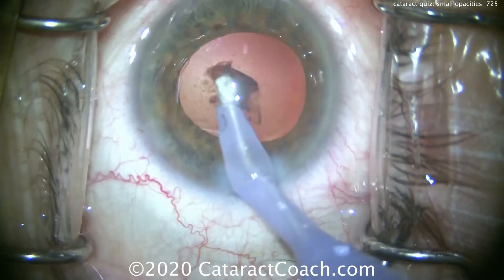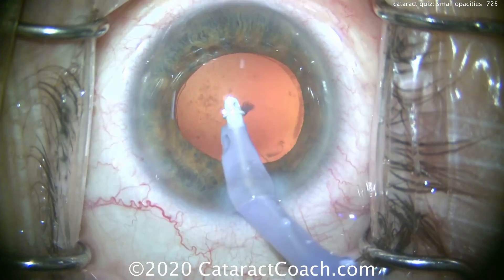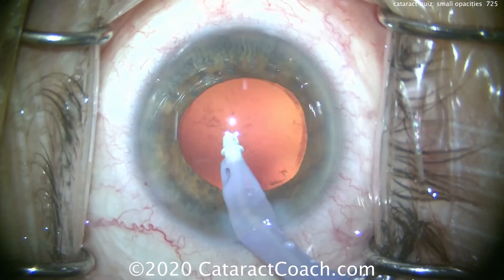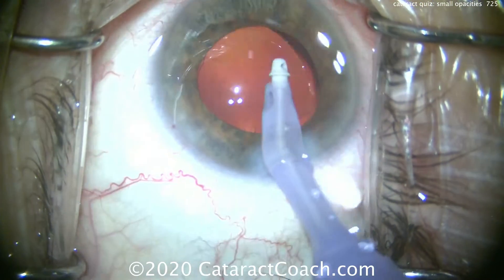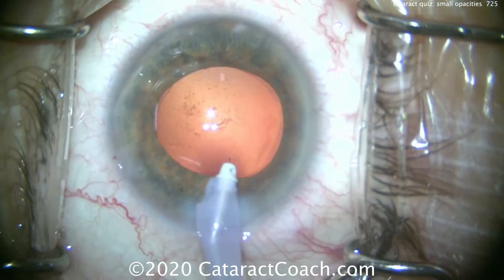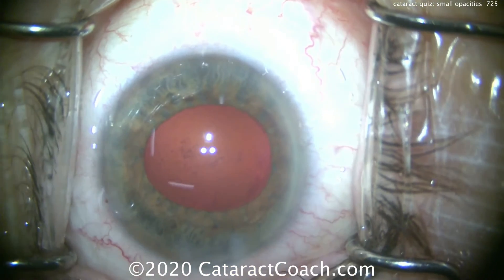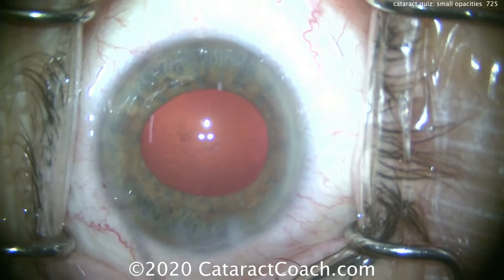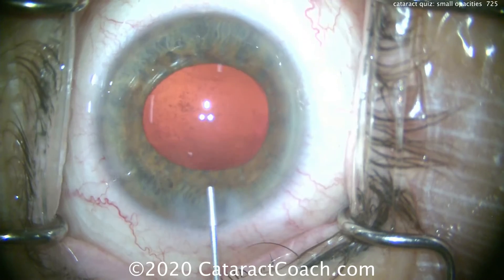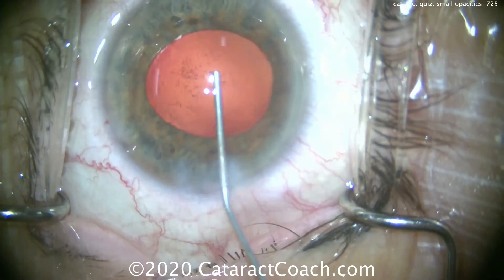Because we chopped up the cataract and emulsified it, tiny bits of lens material go back there. That's not on the front surface of the posterior capsule — it's behind the posterior capsule in the anterior hyaloid face. There's just a tiny bit of lens material there.